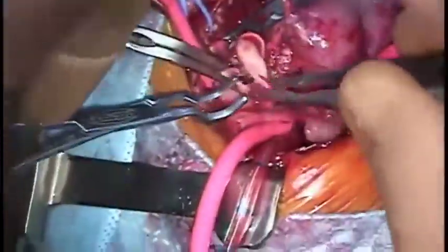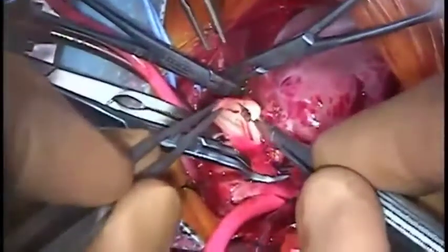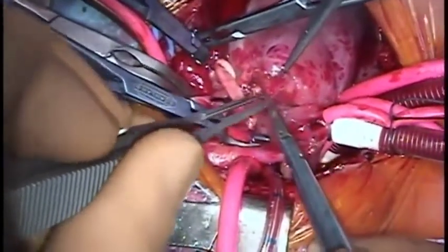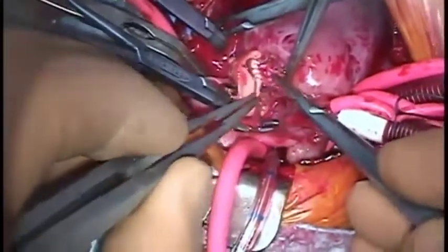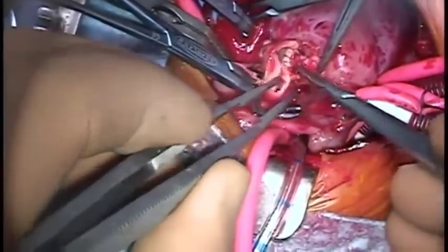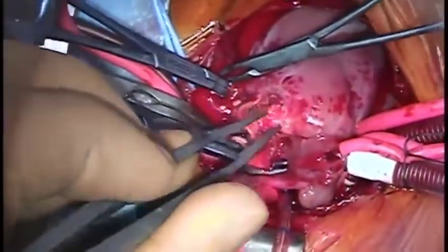Having completed the aortic suture line, attention is turned to the pulmonary arteries. Clamps on the branches are not strictly necessary, as the cross clamp must remain on in this case due to the atrial communication. However, they serve to take the tension off the anastomosis. Once the back wall anastomosis is completed, the anterior wall is sutured.